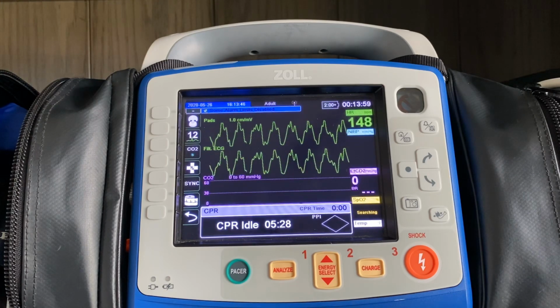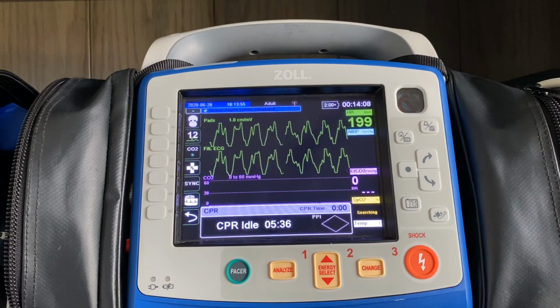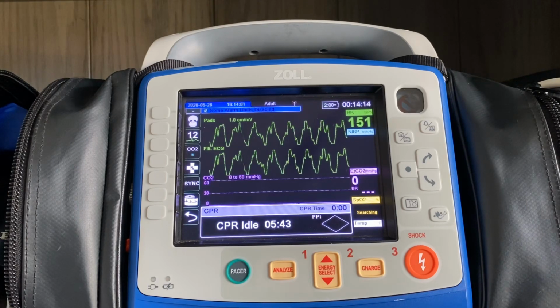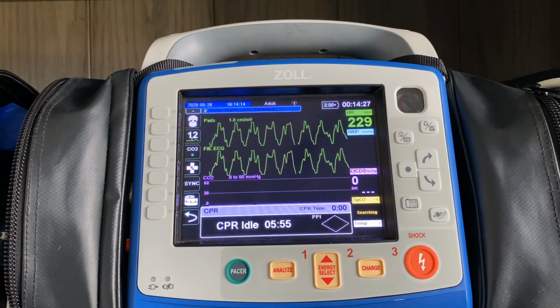You'll use that as your first indication of return to spontaneous circulation. So when you get ROSC back on that patient, and all of a sudden you're putting oxygen in, there's cellular metabolism going on in that patient's body because they're alive now, you're going to have a pressure or a reading of the millimeters of mercury of CO2 leaving that chest cavity. You want that number to be between 35 and 45, and that's going to be your indication that you got ROSC back on that patient.